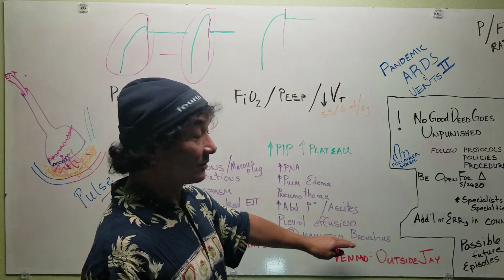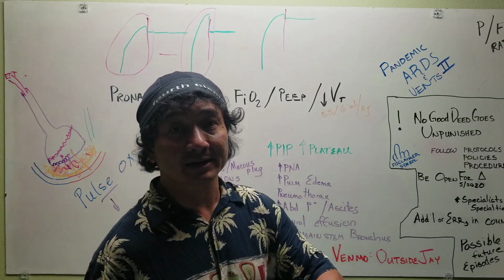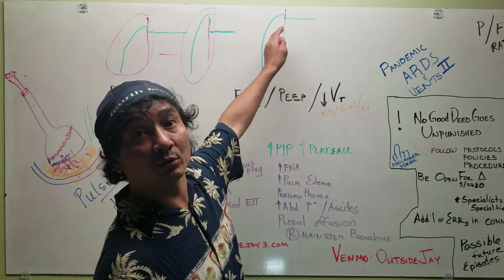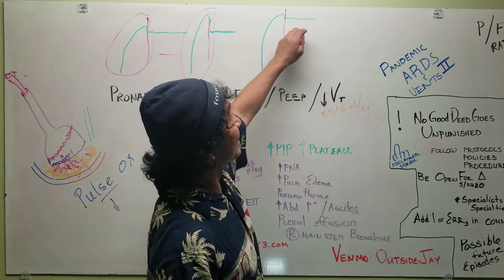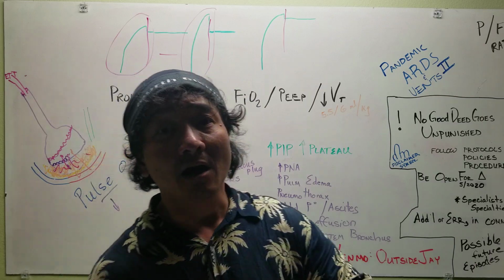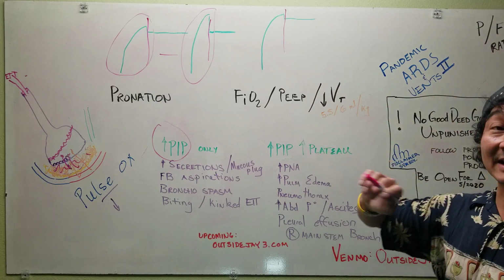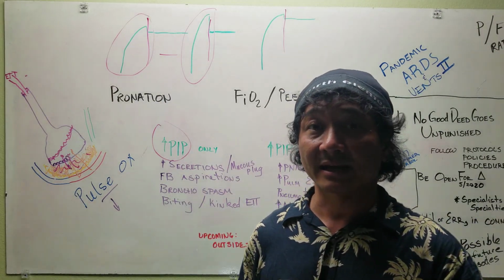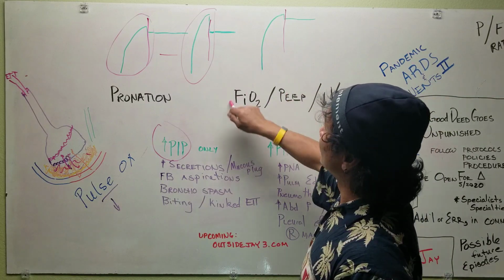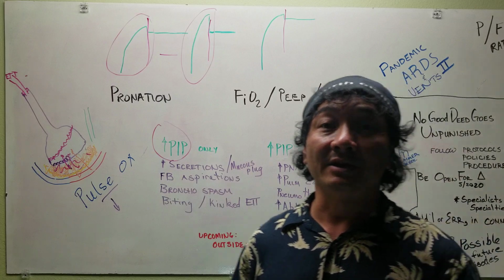Or it could be increasing pleural effusion, or it could be a right main stem bronchus, right? You're not inflating the other lung, and so you're having a lot more pressure, both on inspiration and on plateau pressure. Okay, also, you're gonna wanna know your PF ratio. That's super easy to calculate, so I'm not even gonna go there. But you're gonna wanna know that in order to gauge your FiO2 and PEEP while keeping your tidal volumes low.